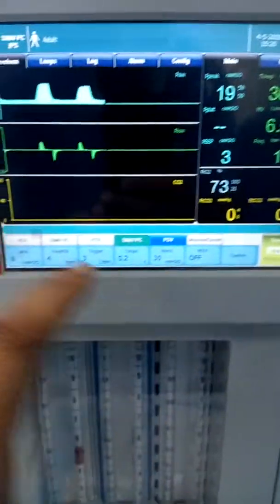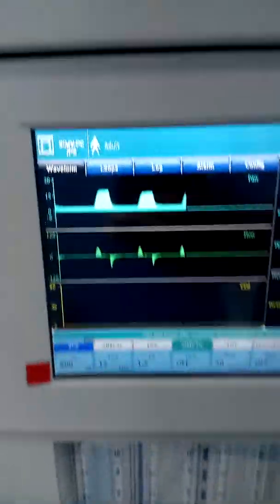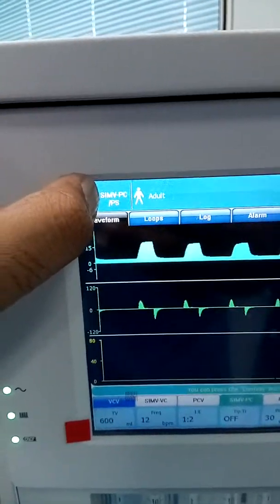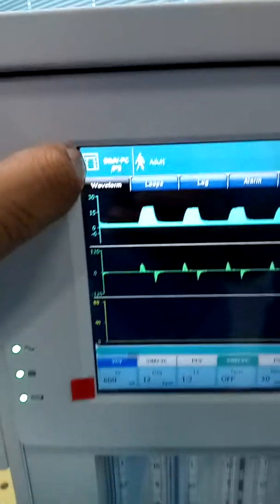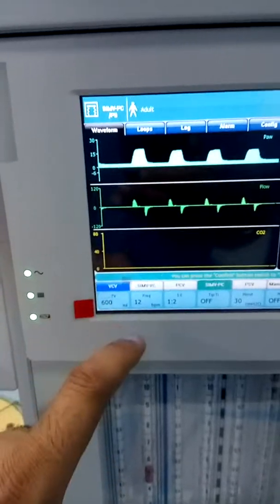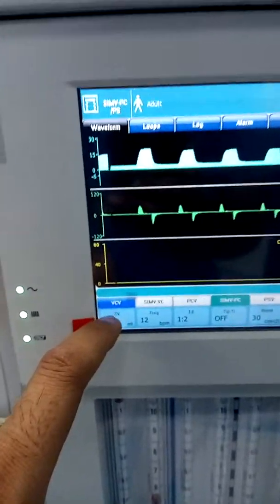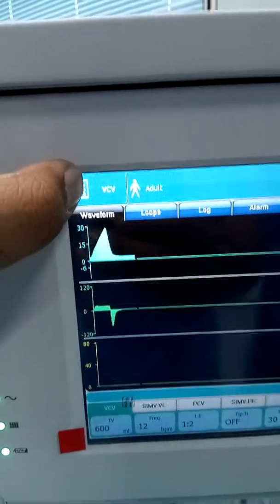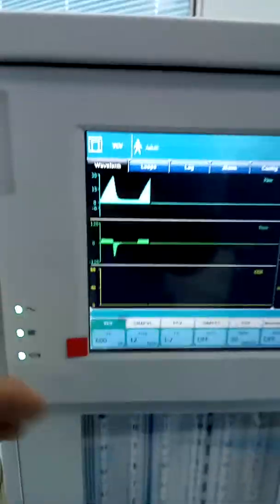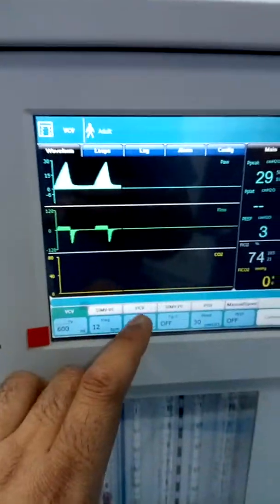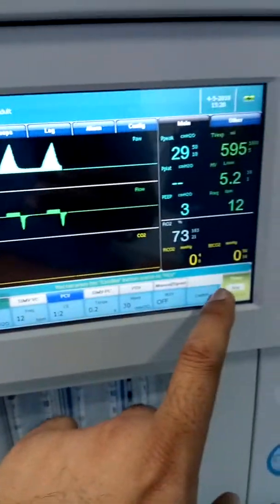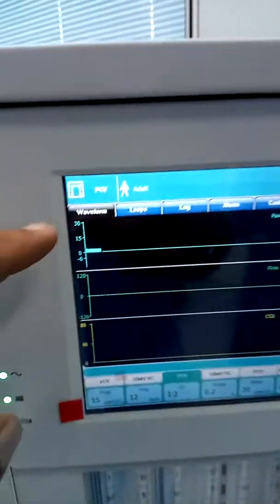The machine is currently working in SIMV pressure control mode. To switch to volume control mode, go and confirm — now the machine is working under volume control ventilation. To switch to pressure control, select pressure control and confirm. Now you can see the pressure control ventilation is active.